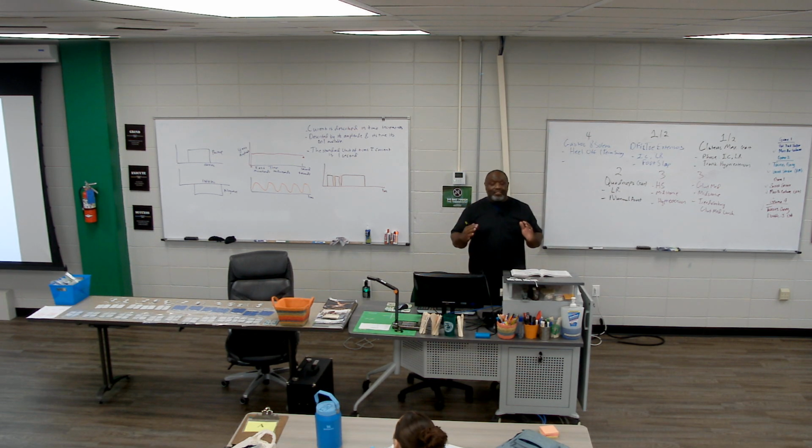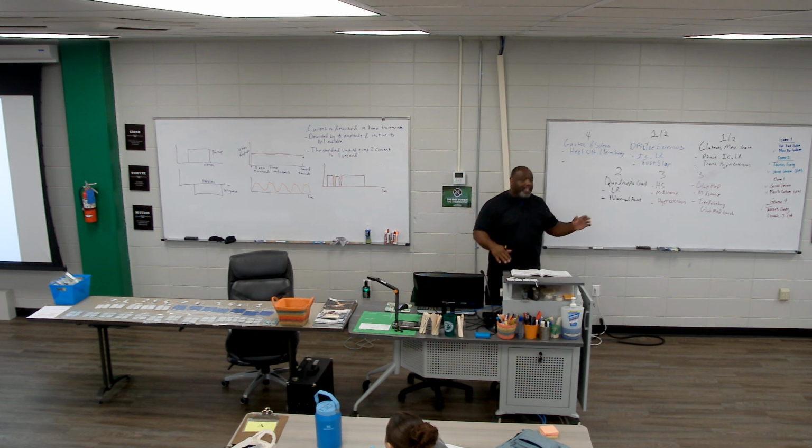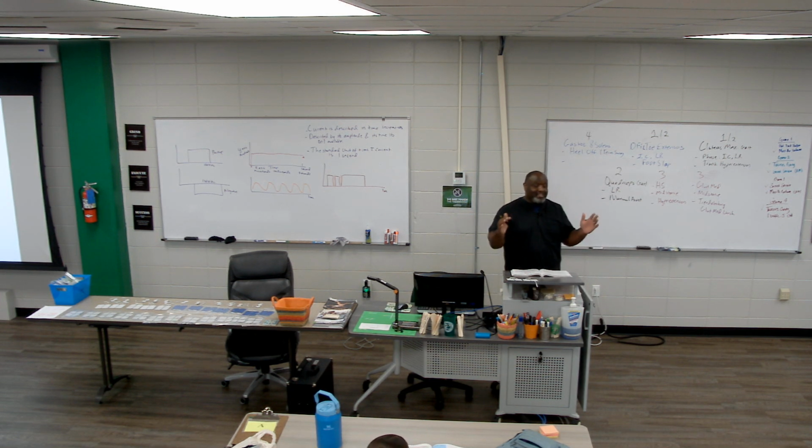They last the same amount of time on the isoelectric line. So this is biphasic asymmetrical balanced. They don't look the same. They have asymmetry in the way that they look, but they are balanced. They last the same amount of time on the isoelectric line. Biphasic asymmetrical balanced is what that's called.